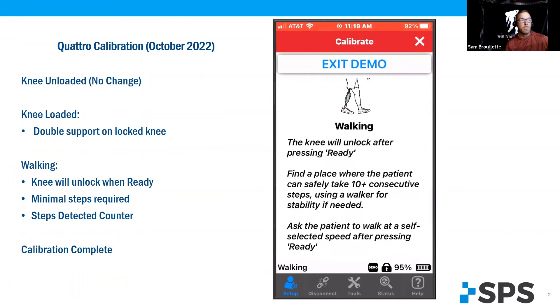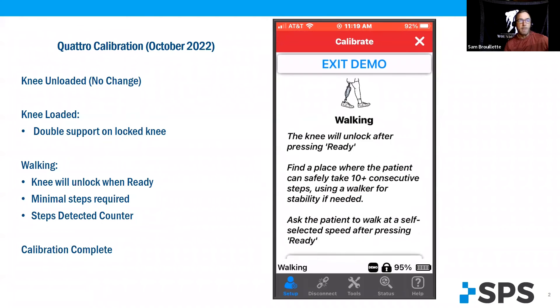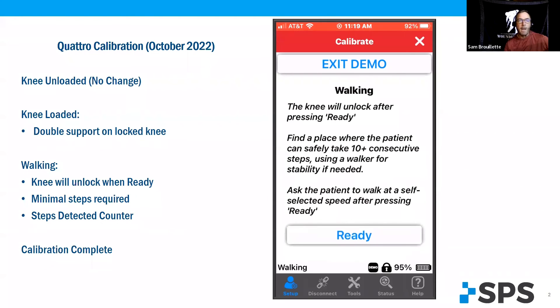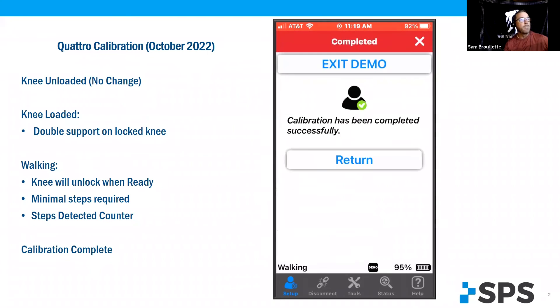Walking — this is brand new and super easy. The knee will unlock when you hit ready. Give it about 10 consecutive steps that they might need. Use a walker or a cane if needed for stability. When you hit ready, have them start walking. You'll notice that there's a step detection count. This can be done in as little as four steps, though it may take a little longer if your patient is using a cane or has inconsistent steps.